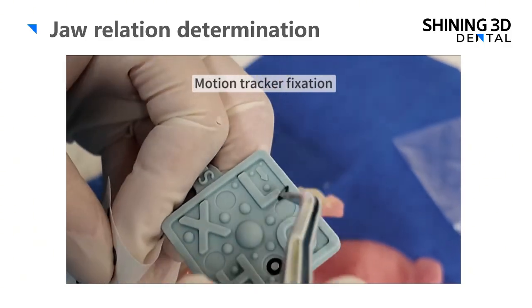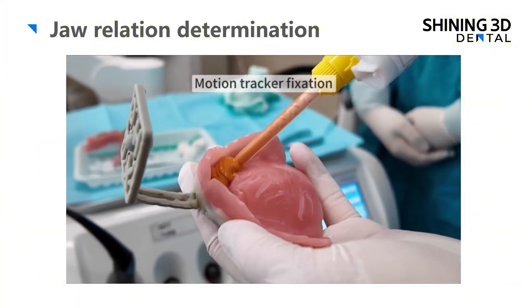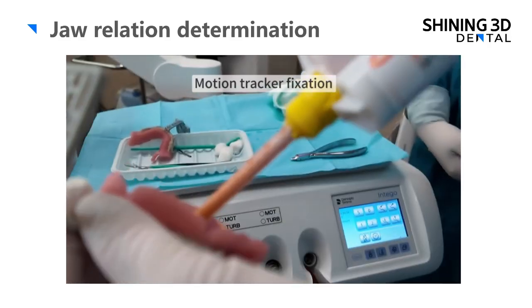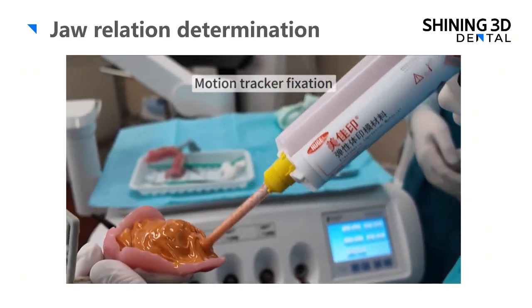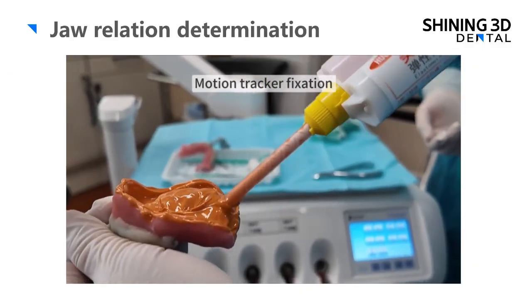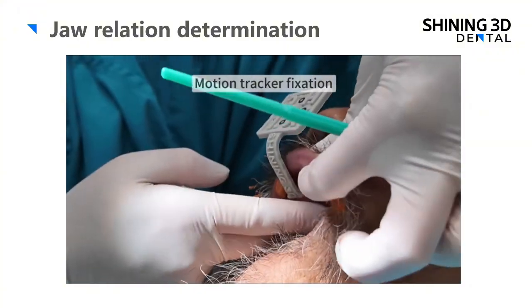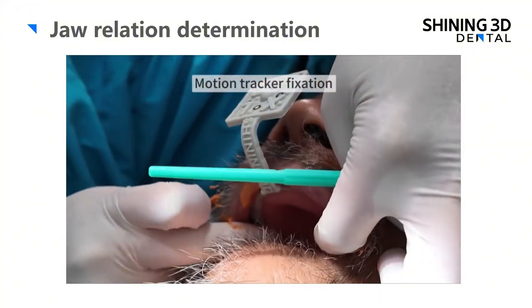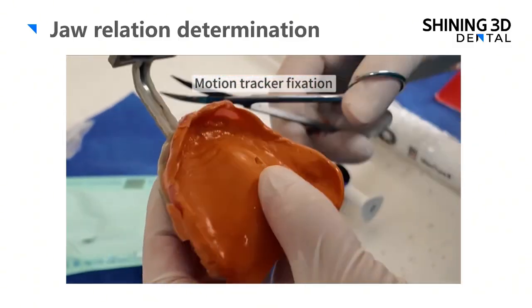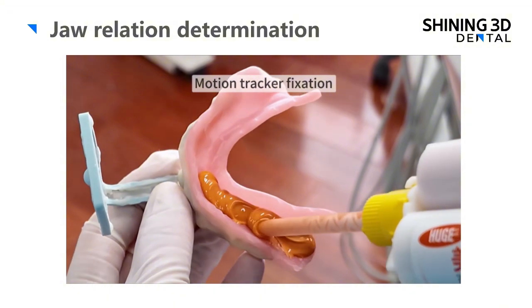In this step, we use markers to pre-make dents on the rubber feature. Then we apply some material inside the fitting surface of two different trays and put it in the patient's mouth, in order to get it stably stuck on the surface of the patient's upper and lower jaw. Once it's cured, we can trim it to increase comfort while we put it inside the patient's mouth to do the tracking for the jaw motion.